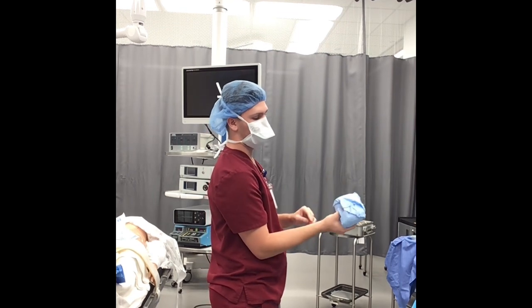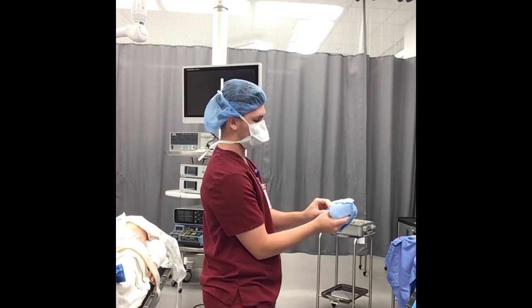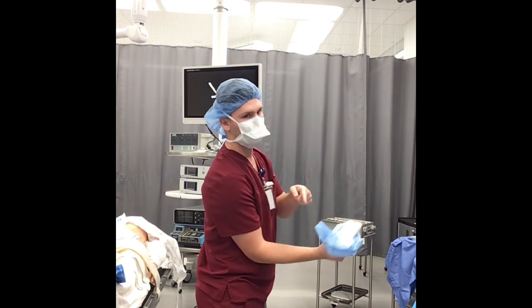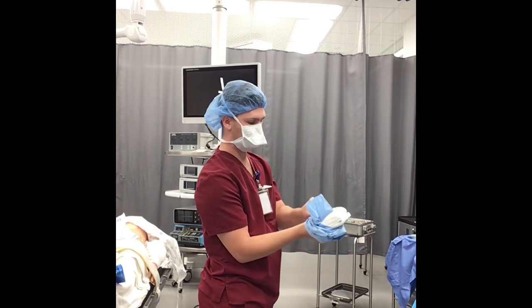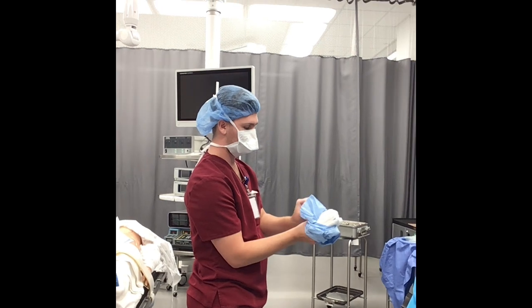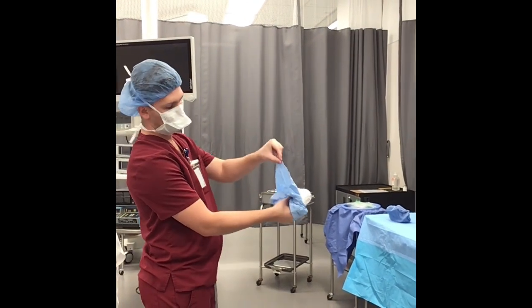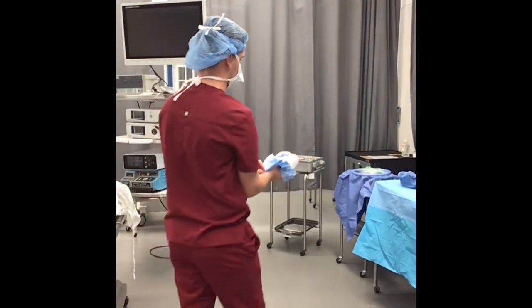And notice how I'm rotating my wrist to open up these side flaps. Same thing here. I don't want to reach over and possibly contaminate, because obviously the sponges here are sterile. And then my last flap is coming towards me. I'm going to keep a hold of this while I'm keeping a hold of my corners that are on the inside here.